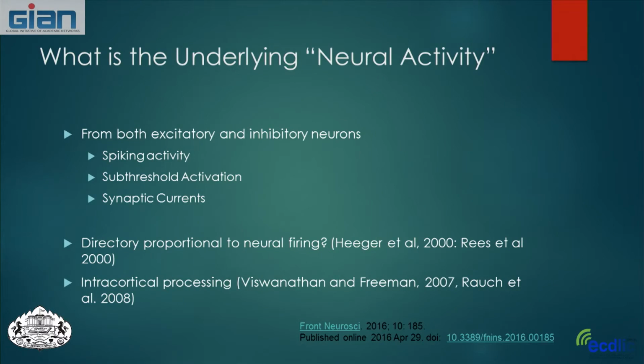So people have looked more into what is this underlying neural activity, right? So I told you it's changes in the metabolic demands, and that is basically what it is. But people have asked the question, because what happens is our body actually sends an excess amount of oxygen to that area, so it really sends more than we need, and people aren't sure why this big change occurs, and they're not exactly sure what this underlying neural activity is. So we're assuming it's the neurons firing, but people have addressed this question in more detail as we've gone through the years of fMRI.